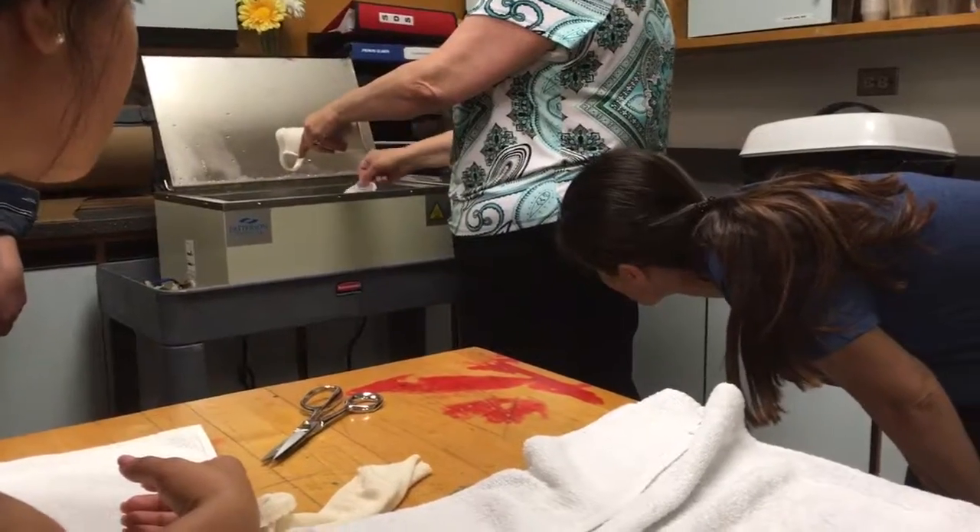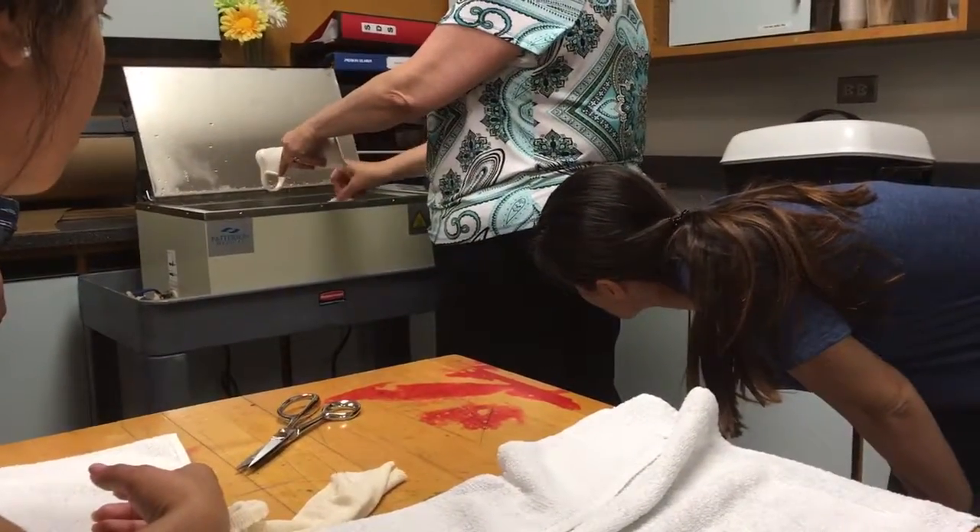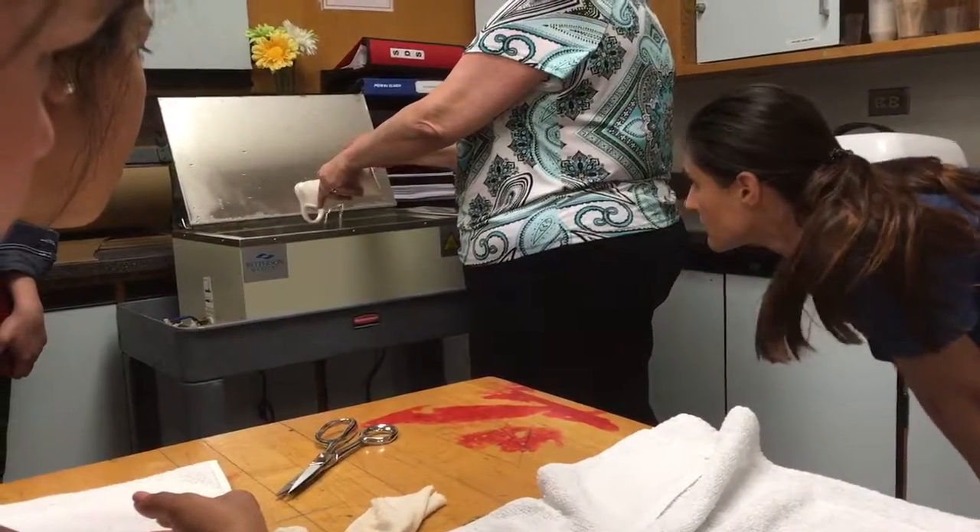Make sure your fingers are out of the way. You have to angle it correctly so that the water is dripping down the right way.